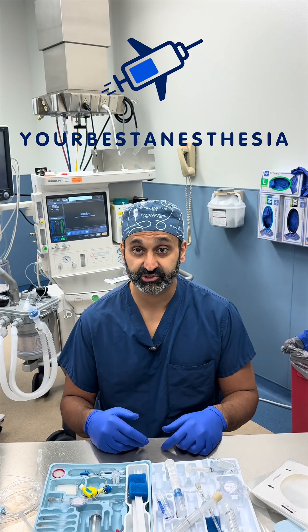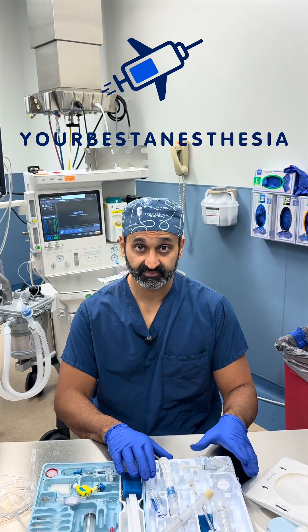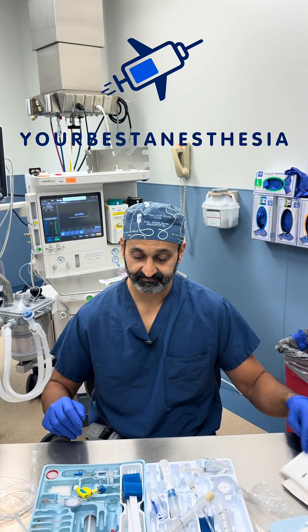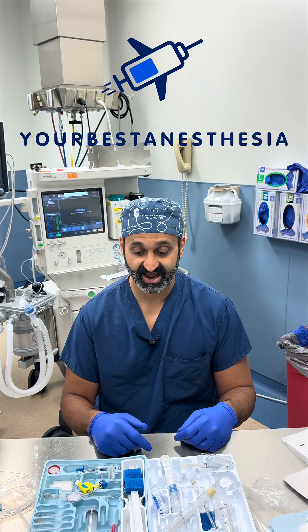So what would be in my dream kit? It would start with the Portex kit. The only thing I would add to it is a clear drape and a wire reinforced catheter.